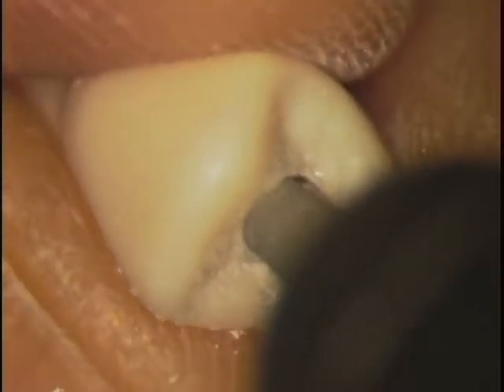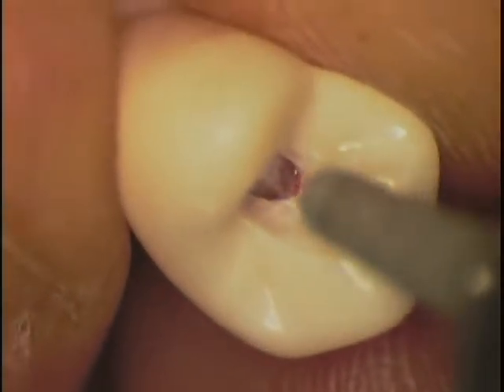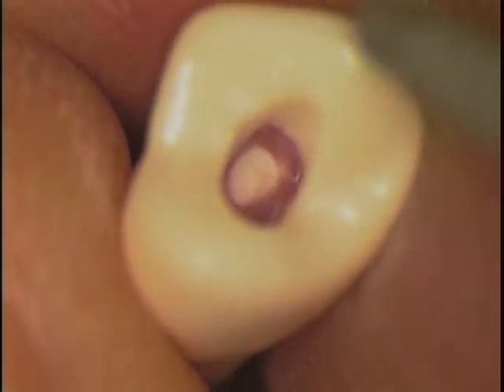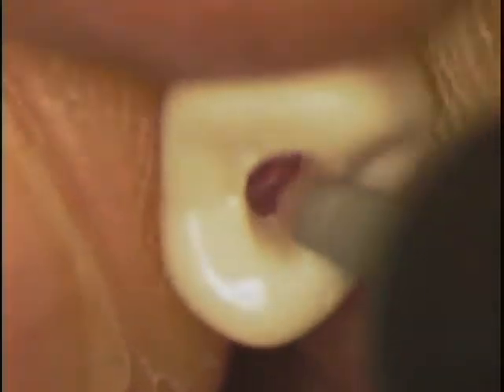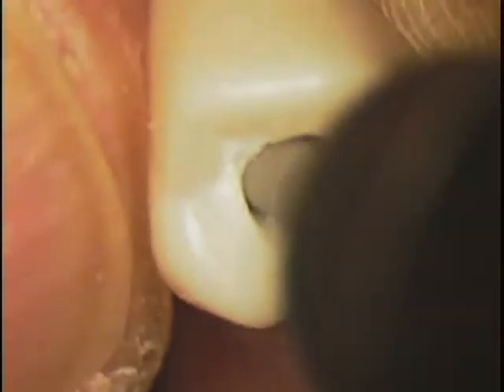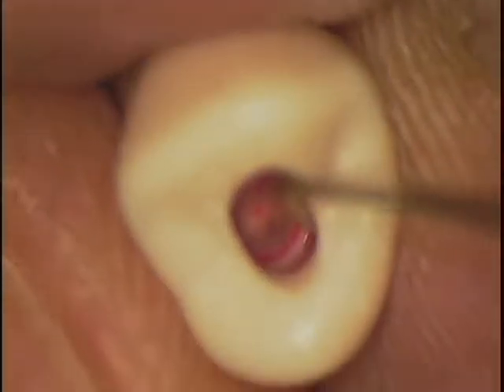So here's my, you see I just gently, you can turn your tooth the other way. All right. And now I'm getting rid of a pulp horn. And this one. So you can see the access is not just creating a hole. You have to get rid of compartments, different compartments within the chamber itself.